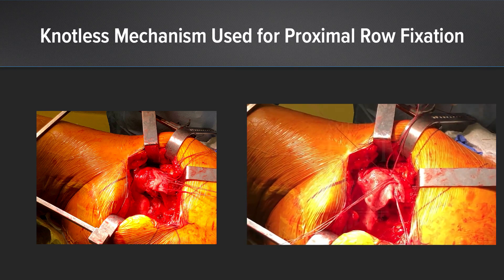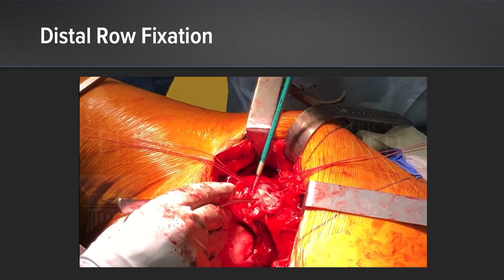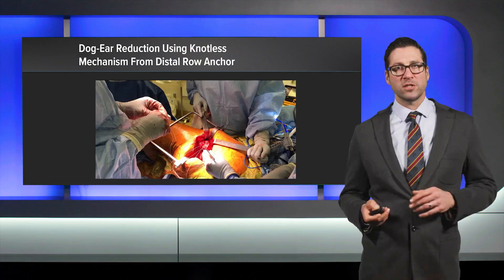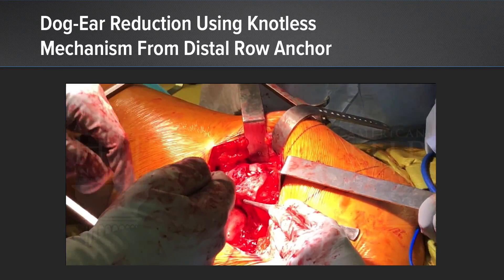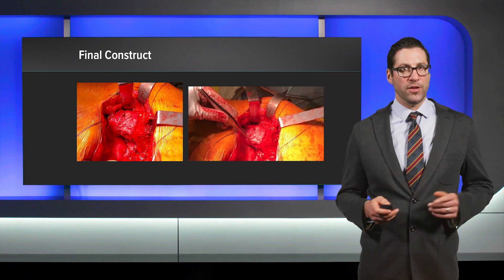We cinch the mattress stitch using the knotless mechanism in the swivel lock, then proceed to distal row fixation with swivel locks. Here we complete the first anchor in the distal row, bringing the fiber tapes from the proximal row across the graft and tendon complex. Finally, we can perform dog ear reduction using the knotless mechanism from the distal row of swivel lock anchors — the dog ear of the graft is reduced with a simple mattress stitch. The final construct approximates a broad surface area of tendon and graft supporting the tendon across the lateral facet and posterior superior facet of the greater trochanter.